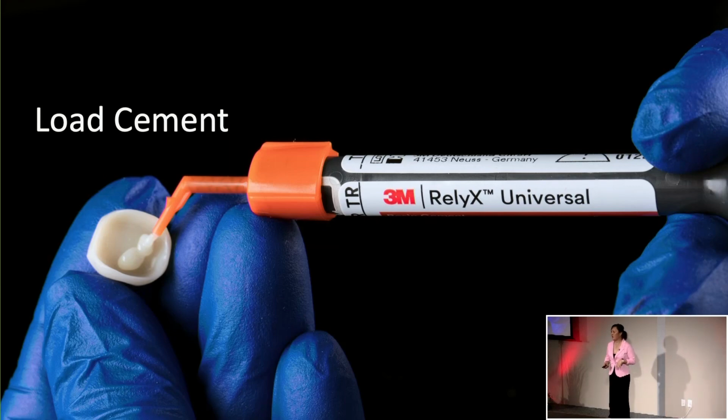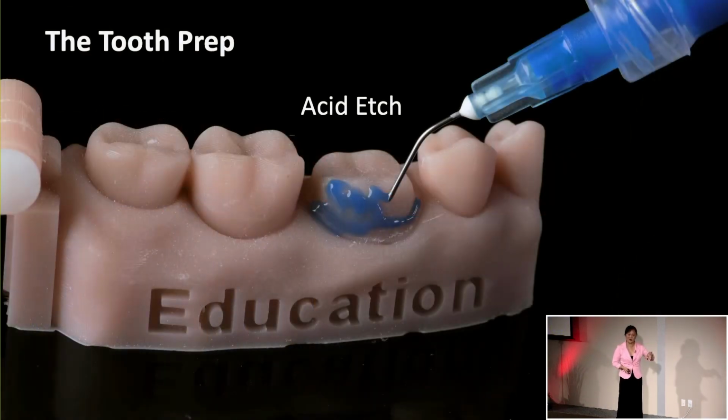Loading the cement, I want to show this because you do want to make sure that you have a fair amount of cement on your restoration before you plop it on the tooth. If you don't have enough, then you're going to have cement voids, and that can create a lot of sensitivity, and it's not good overall. So you want to make sure, I like to load it up at least 3/4. That way you get that nice cement squish. For the tooth, I like to use the full acid etch technique.